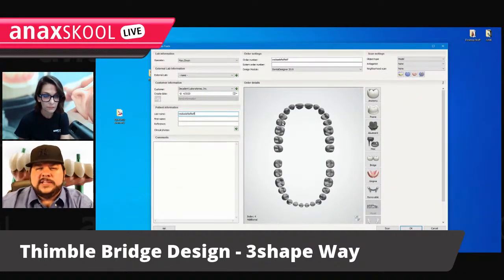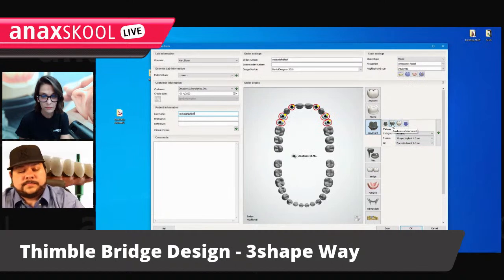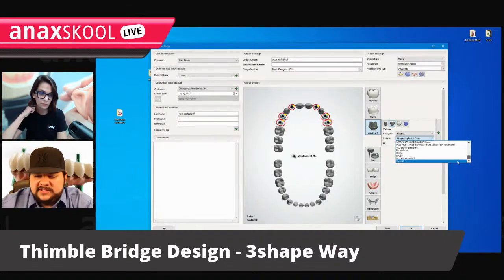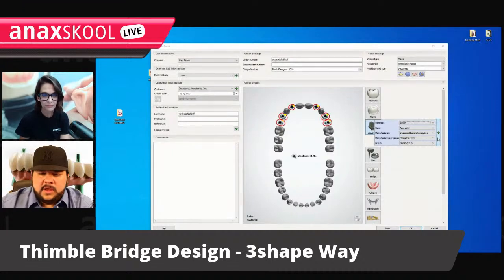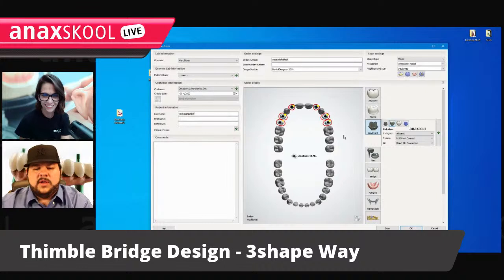What teeth are we doing? We're doing the adapt. So let's pretend we are, because we're going to go the other order. I don't remember what teeth it was, but let's pretend these were our implants, right? We're going to choose our multi-unit anatomical crown. So we choose the anatomical abutment. And we're going to choose whatever you like, whatever you're working with. That's a whole other ball game. Let's choose this. Something I made on was direct to multi-unit, right? Choose your material. Let's go with some Pecton. Of course. Why not? Printed, milled, whatever. So those are the screw-retained crowns on the implants.